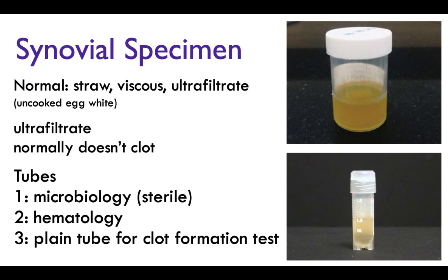You could be doing other stuff too. This is not an exclusive list. Typically when you get a specimen like this, you would get something like that top specimen, and then it would be your job to distribute it out to the correct department. So it's not quite as mandated to have the first tube here, second tube here, third tube here, like it is for CSF, because just the nature of how you're going to receive it, it's all kind of going to be mixed in anyway.